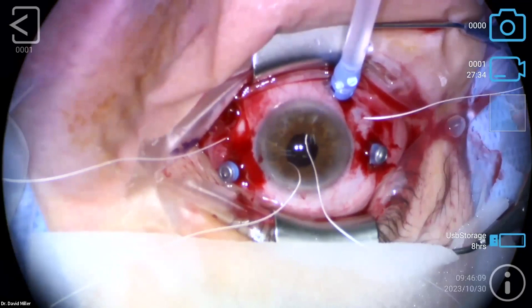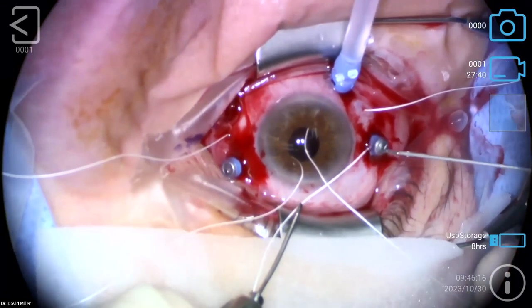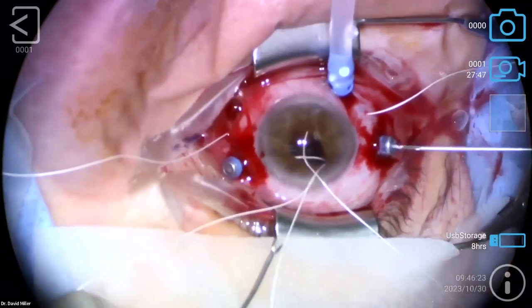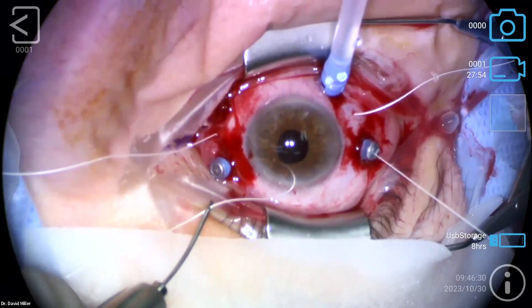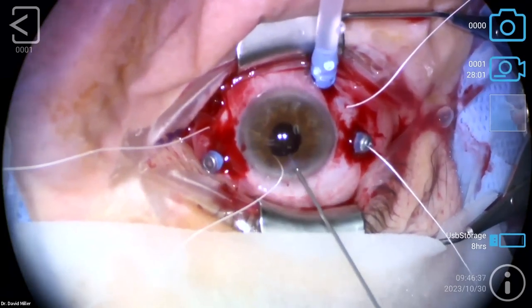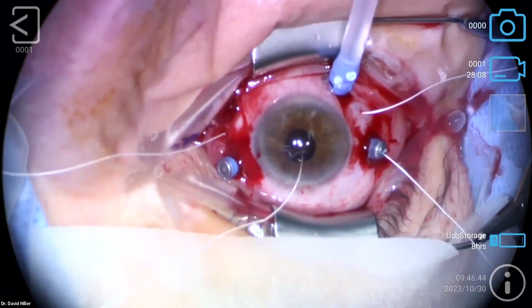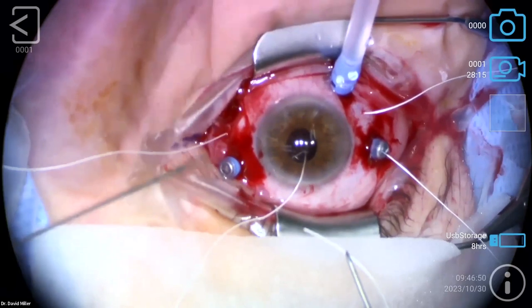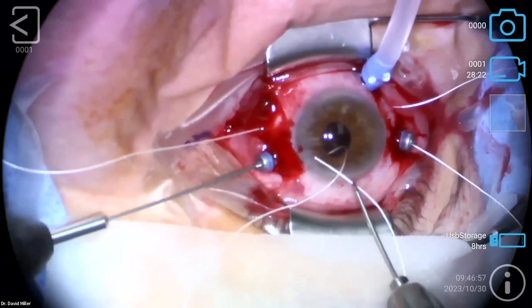So we're going to grab the other end of that suture and thread it where it belongs. And again, we want to try and keep everything just like it's supposed to go. There we go. I'm good. And again, if the lens implant is a little further back, it's a little easier, so it gives you room to stay on top. Part of the reason I like the sutures being on top when I place them is that I can work above the lens to make sure nothing's getting tangled. One of the problems we ran into with this procedure when I was first learning it, right? I didn't create this. Many others before me did all that.